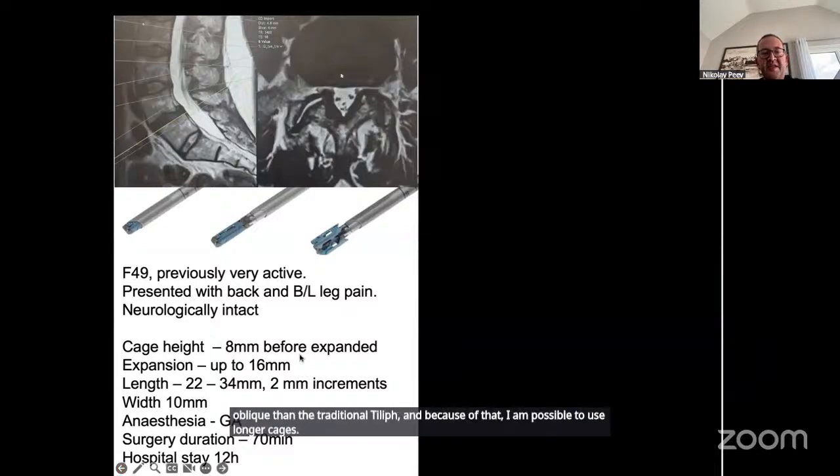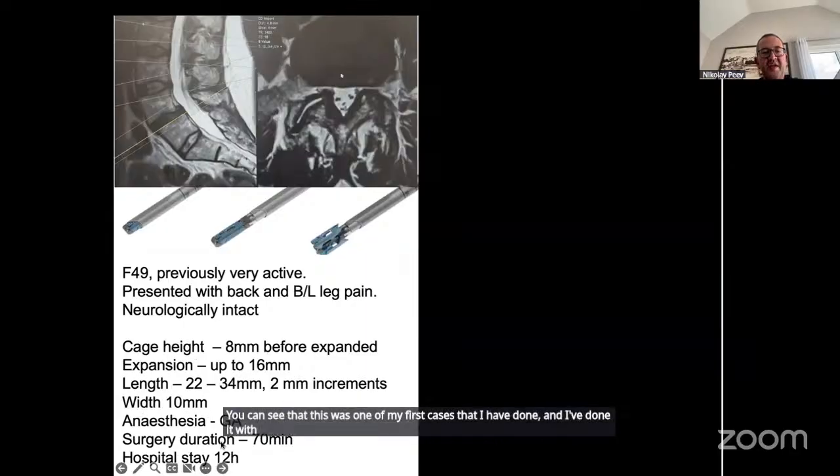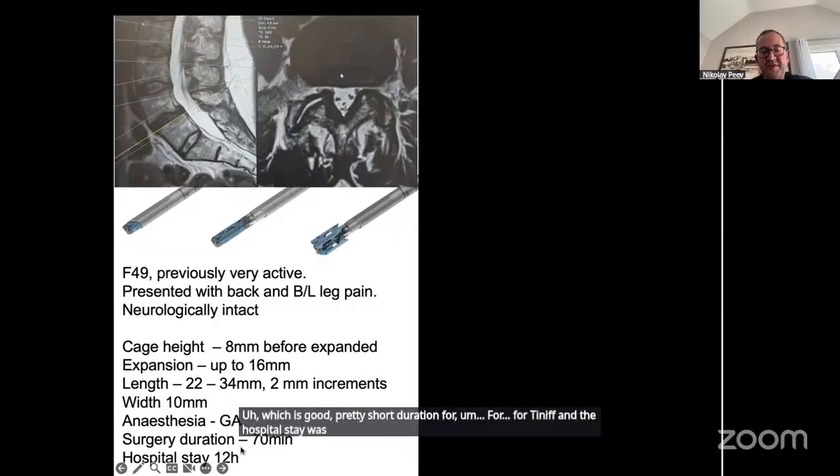You can see that this was one of my first cases that I have done, and I've done it with general anesthesia. The surgery duration was 70 minutes, which is good, a pretty short duration for TLIF, and the hospital stay was 12 hours. The patient was discharged.